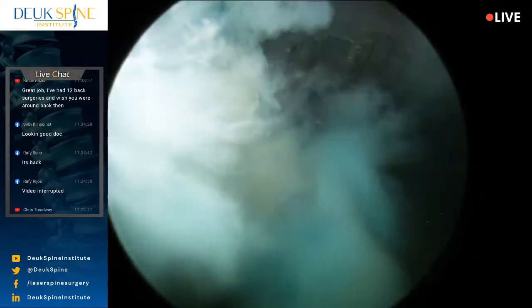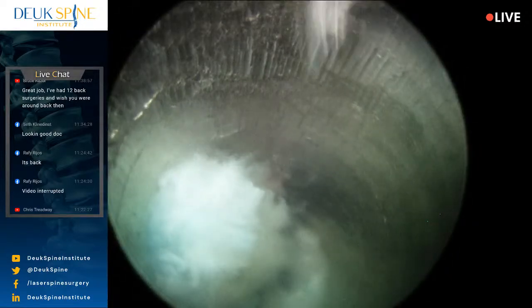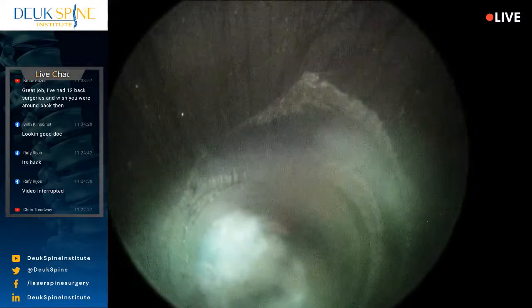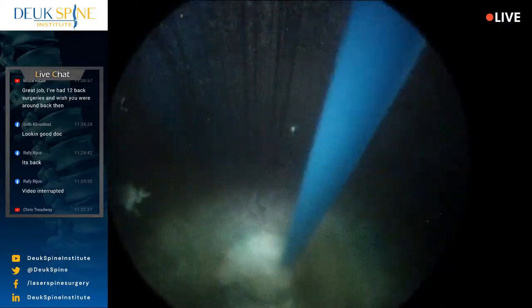So you can see all the damage done to the disc. It's just fragments of herniation. So I've got to grab out as much as I can. I'm going to use the laser to clean up the tear. You can see the annular tear right there. So we're going to clean that up. Laser's on, correct? Yes, sir.